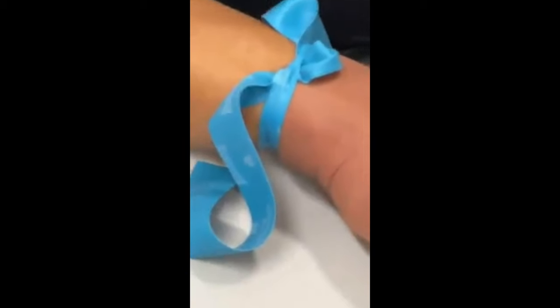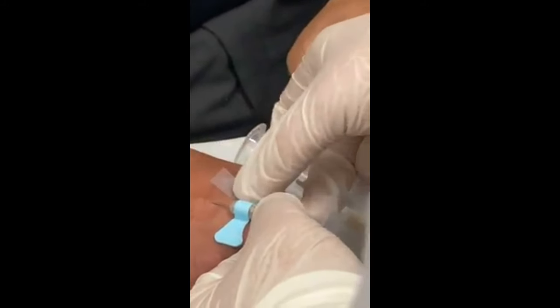Oh yeah, you could actually put it here, or I can put it there. Yeah, go ahead. And what I'm going to do is, okay, the tape right here. There you go. Perfect. Okay, and then go ahead and just do your tube. And let's say the tube, blood is flowing in there.